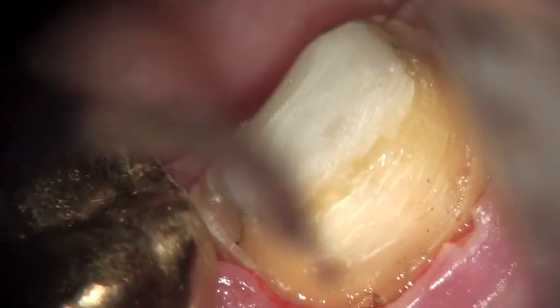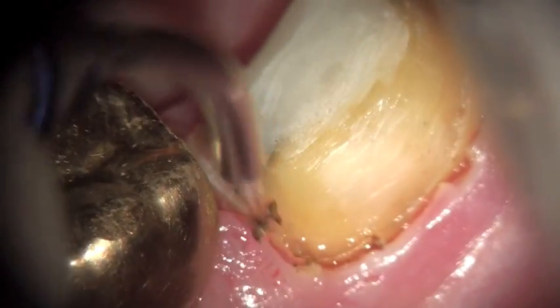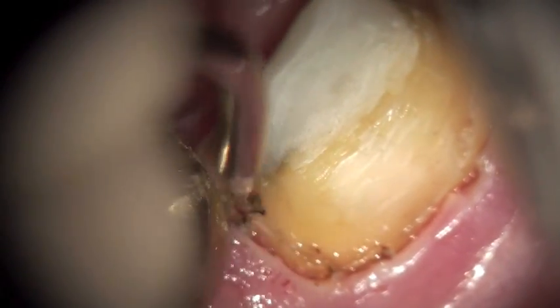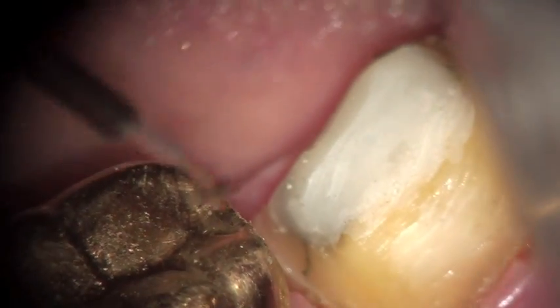This is videotaped through the operating microscope. You can see the mesial aspect of the tooth now. As the coagulant builds up on the tip, you should remove it — it probably should have been removed a little bit more here. We're just creating this trough, and you can use Expasyl or Traxodent afterwards to try and laterally distend the tissue.